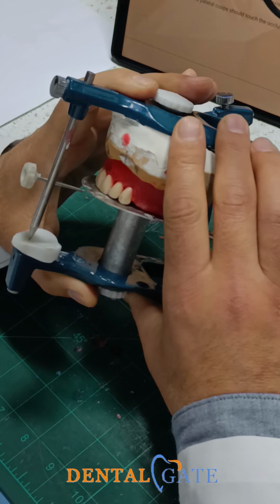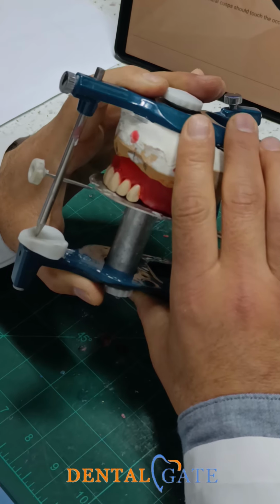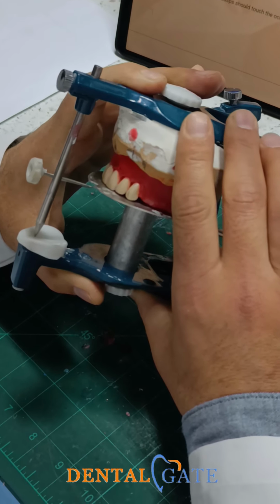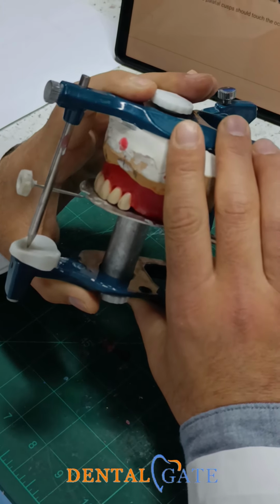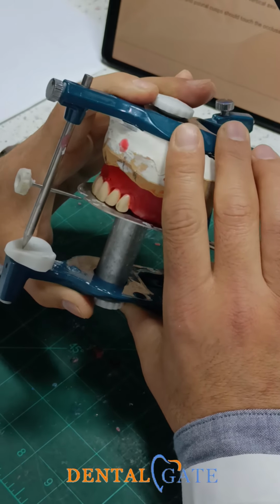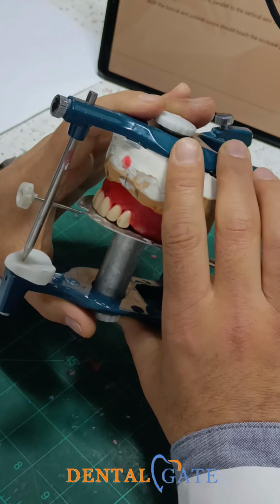When we say this cusp, it should touch, and this cusp and the other one should not touch the table. That means we will make the curve to compensate the mandible movement, to compensate the lateral movement, to compensate forward movement, protrusive, all these movements. It will be properly accomplished within these criteria.